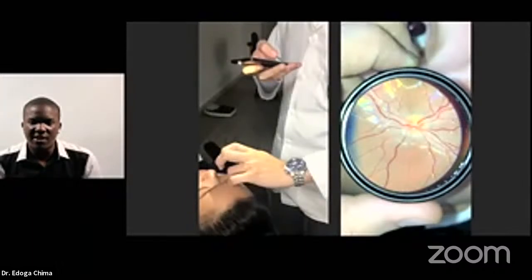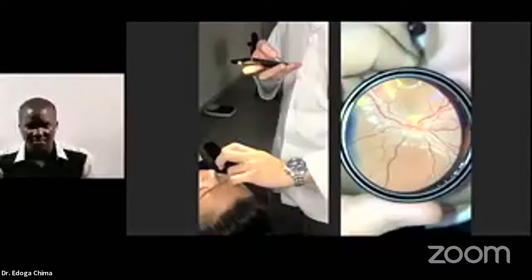The second advantage of using this while the patient is lying down is that the patient's head is rested on the bed. So the patient is not hanging his or her head, because you need maximum comfort for the patient in order to get the best out of this procedure.